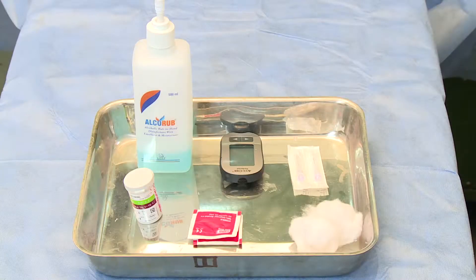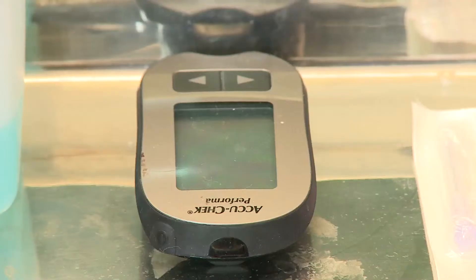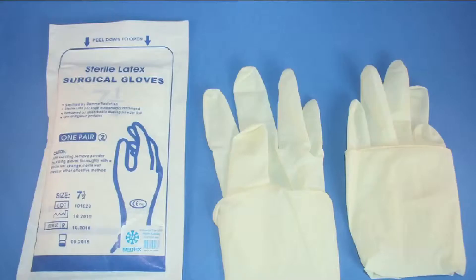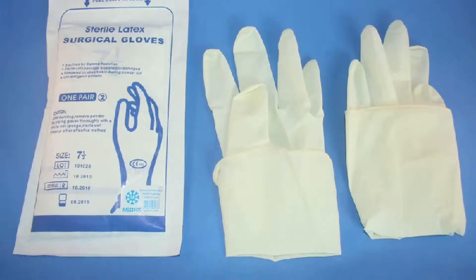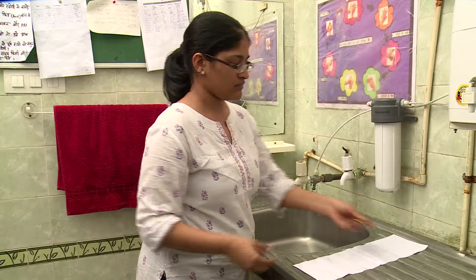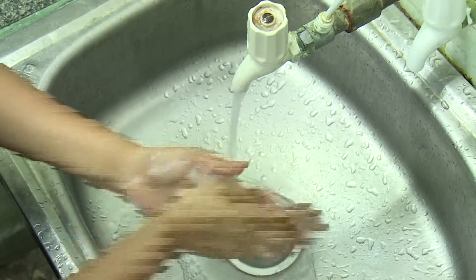How to take blood glucose: ensure that all necessary equipment and materials like glucometer strips, alcohol swab, needle, and gloves are at the place of procedure before starting. Remove all hand ornaments like rings and watch, then wash the hands thoroughly with soap and water.